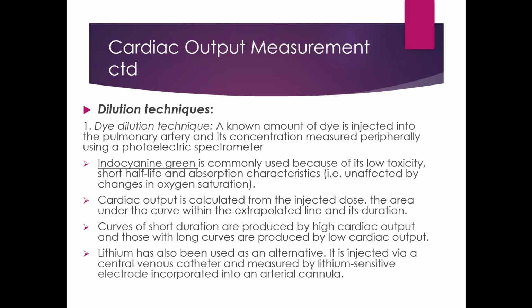So you do this and plot a concentration versus time curve, and cardiac output is calculated from the injected dose and the area under the curve. Its duration can also be used. Curves of short duration are produced by high cardiac output, and those with long curves are produced by low cardiac output. So you can use that.